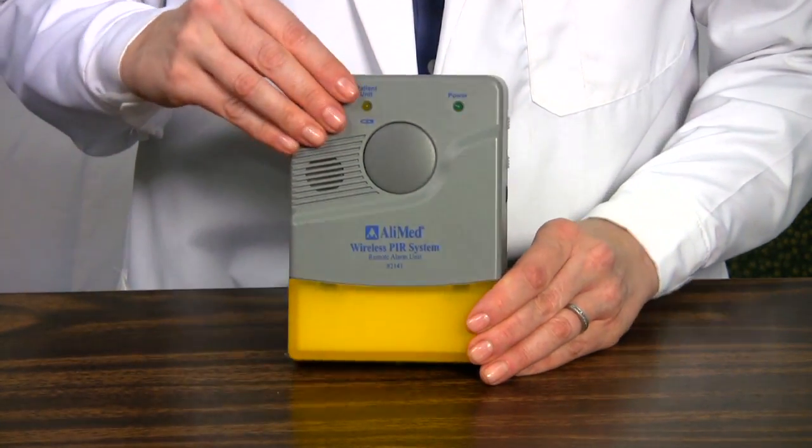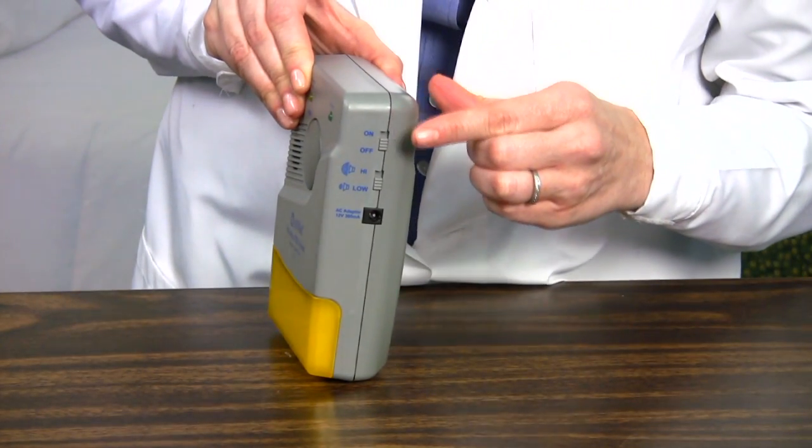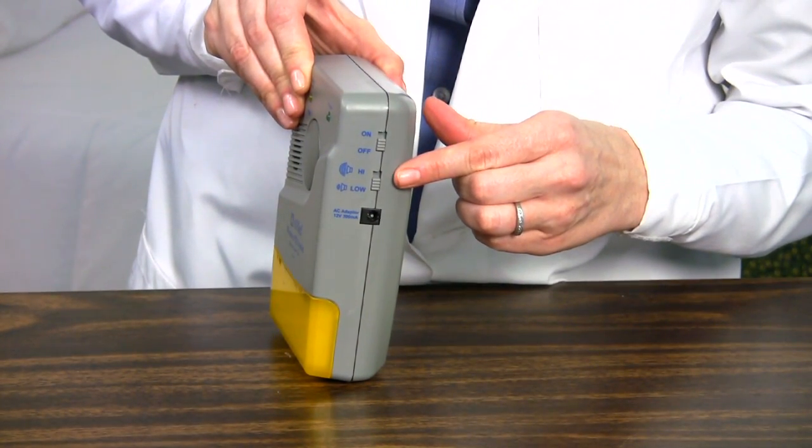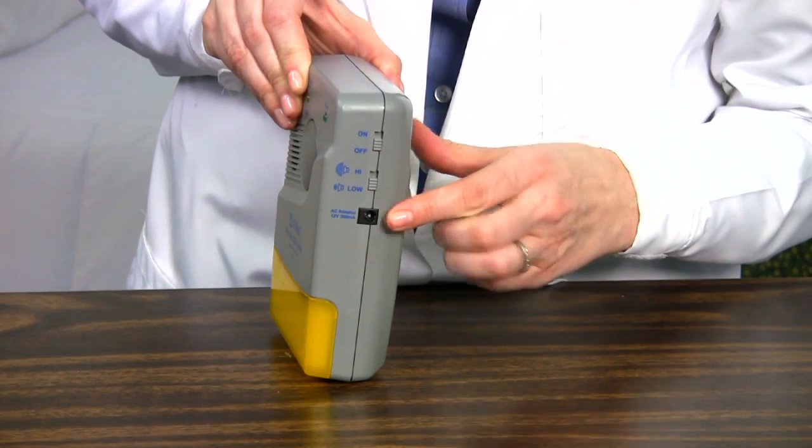To the side is the power on off selector. Just below is the high low volume selector, and below that is the AC adapter port. You may order an AC adapter separately.